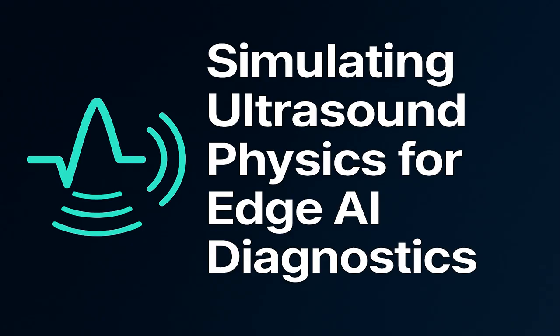Yeah. Why is a phase shift computationally so much better than a convolution? Well, time domain convolution scales very, very poorly. If you double the number of data points you're working with, the computational time can increase by fourfold or even more depending on the algorithm. It's just incredibly resource intensive. In contrast, a geometric travel delay is just a time shift. We'll call it tau. In the frequency domain, a time shift becomes e^(-j2πfτ). It's a simple, elegant, complex multiplication that you apply element-wise across all the frequency bins. So you're turning a huge, slow calculation into a quick, simple one. Exactly. This transformation is what fundamentally makes simulating complex physics across millions of data points tractable and efficient.